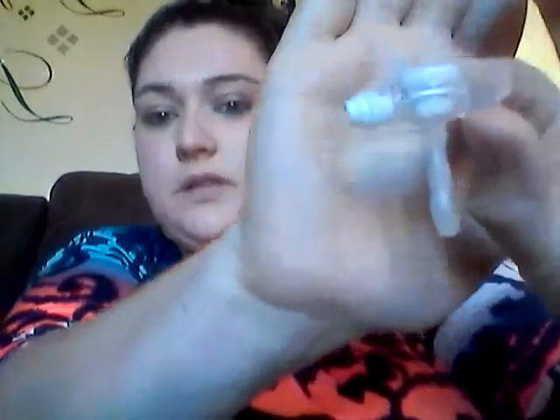So this is what his Mickey button looks like, and it's got a port here on the side, and this is where you check his fluid levels. You just take like a 3 cc syringe and put it right here, and then you can check to see how much fluid he's got, if he needs more. We usually try to keep 3 in there. Some kids might need more, some kids might need less. Just talk to the doctor. But it opens up, and you want to keep it closed whenever it's in and you're not feeding.